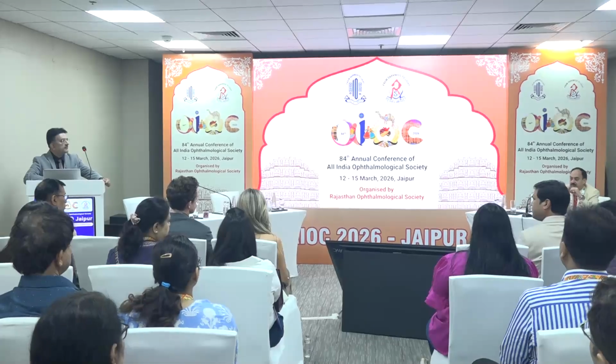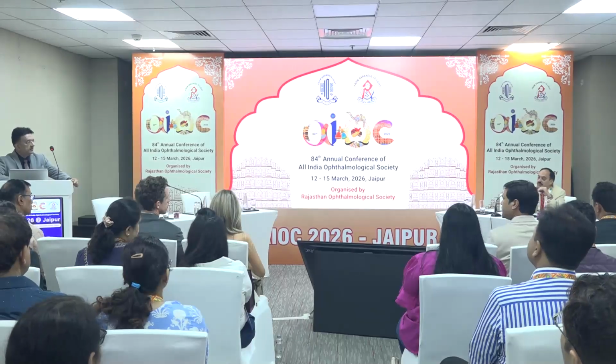Thank you. I think piggyback is much easier and much safer in myopic eyes because you have a larger AC depth, so you can plan that. Absolutely. And about this three-piece Alcon you had to put because of the power, Rayner has hydrophobic IOLs which go up to -8 diopters. Those are one-piece IOLs, so that you can plan in case you don't want three-piece IOLs.